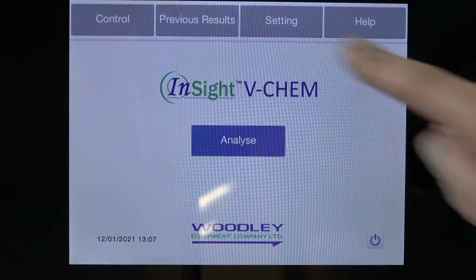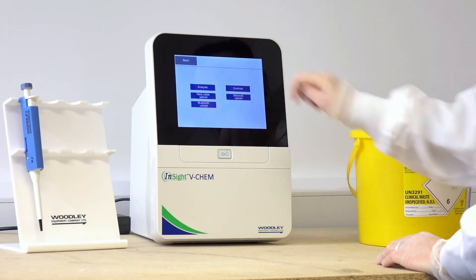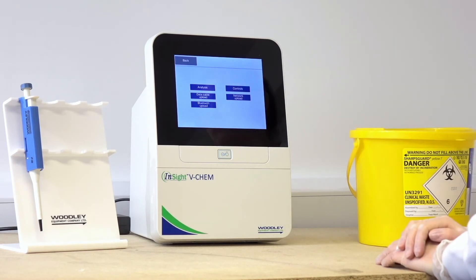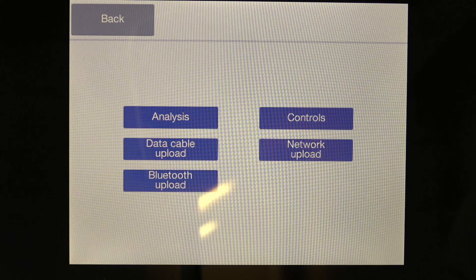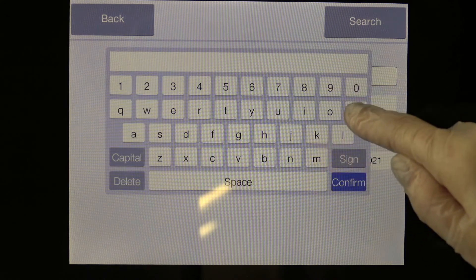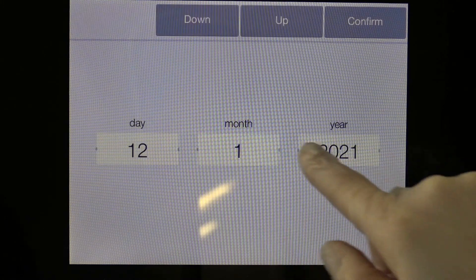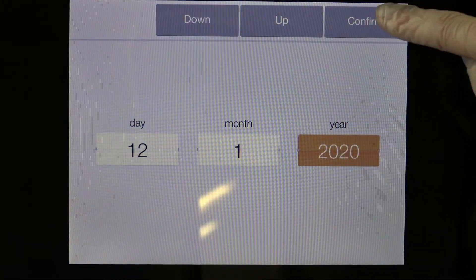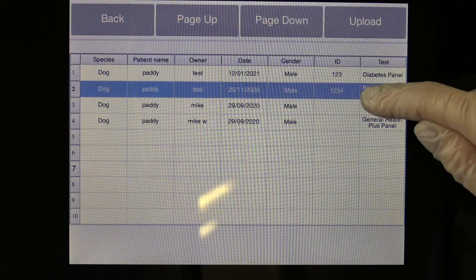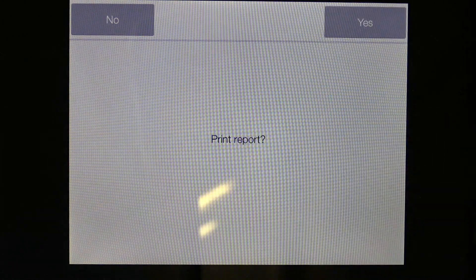To view previous results, select Previous Results from the main screen. Select Analysis to search for patient results, or Controls to view previous QC results. The other options shown are to upload results via the different connectivity options. For searching patient results, select Analysis and use any of the fields to filter results. Ensure the date is adjusted to search for results within a specific time frame. Select Search and the filtered results will now be displayed. Select a result to view. Previous results can be reprinted on the built-in thermal printer by selecting Export and Print.